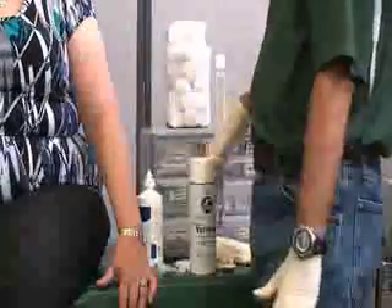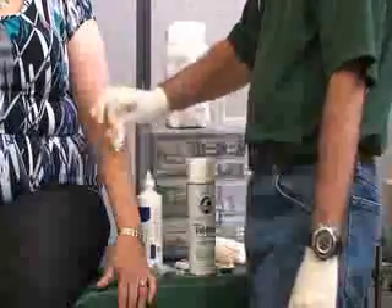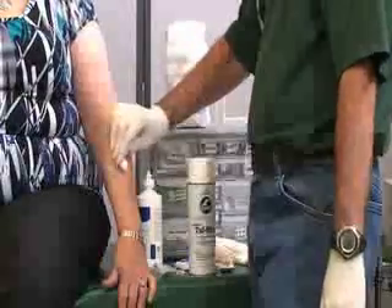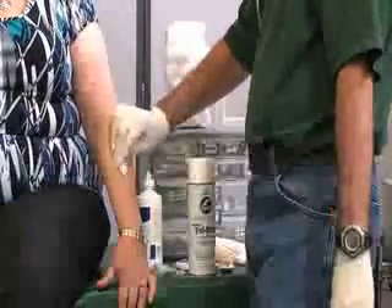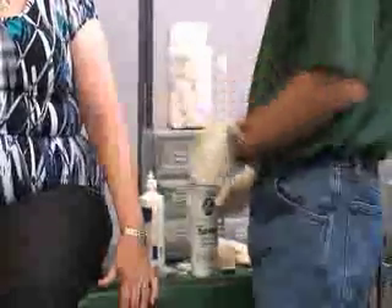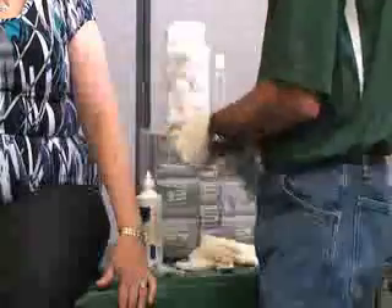After we inspect the wound, we can help control the bleeding with our gauze. Once the bleeding stops and we know the size of our wound, we want to make sure that the sides of the Steri-Strips or the butterfly bandage stick to the sides.